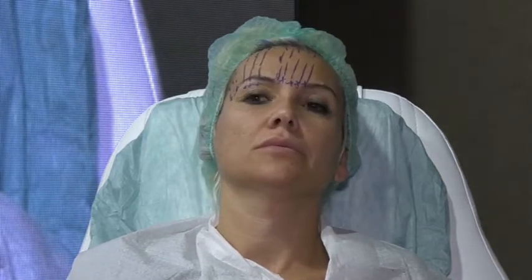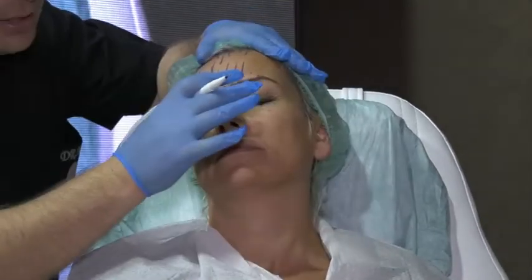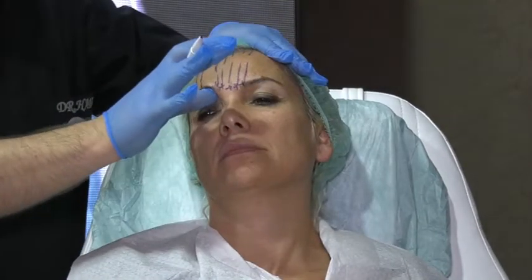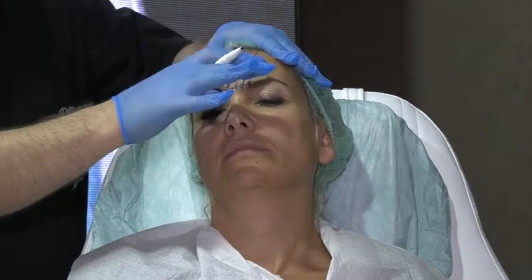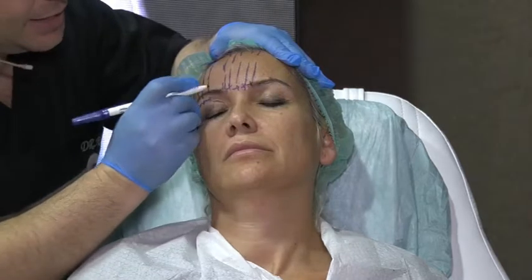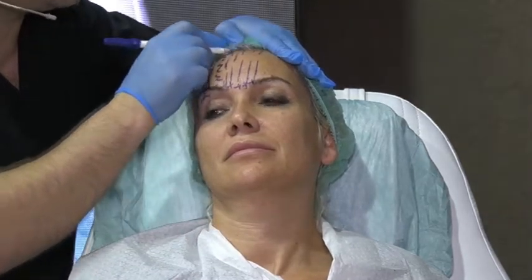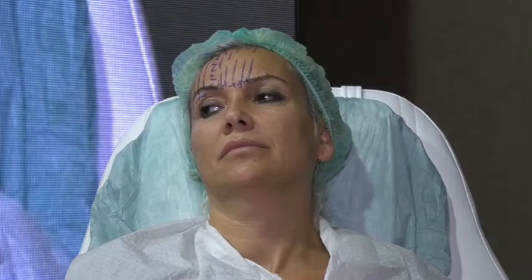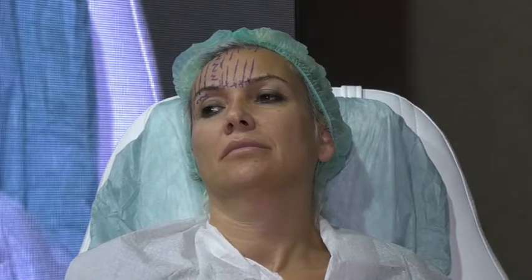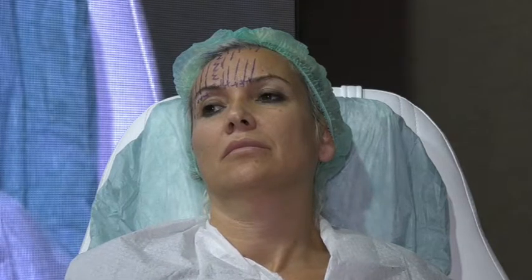So now I told you I can put threads everywhere I want except what? Look, what is this? What is that? Supraorbital notch. Okay? So this is the only point that I hate. This one, look. This one is bad. Don't put the threads here. This is, as you see, like 1.5 centimeter from the inner part of the eyebrow. Okay? So, now we finish the story of the eyebrow.